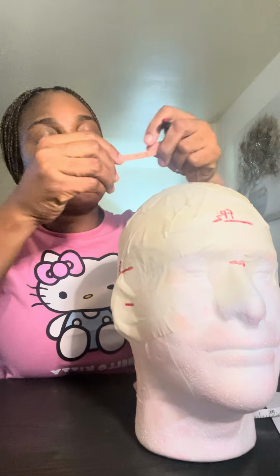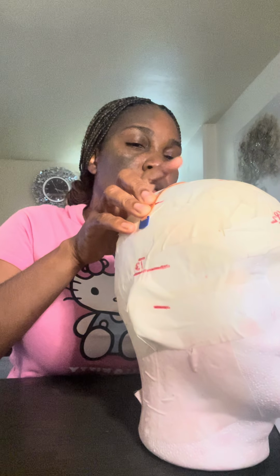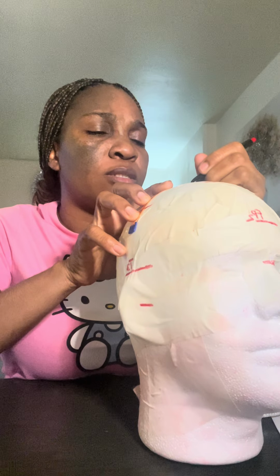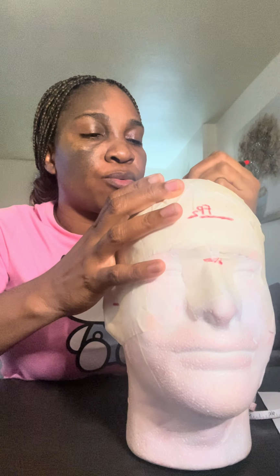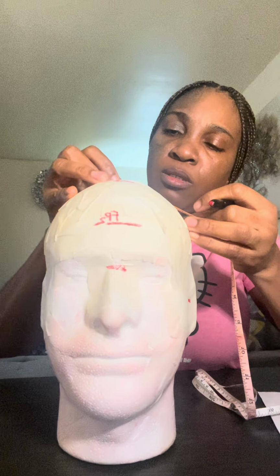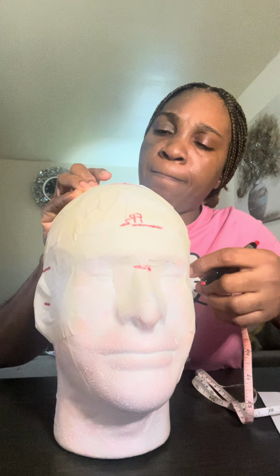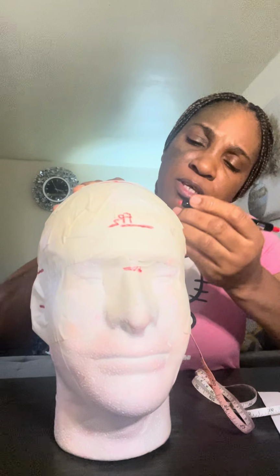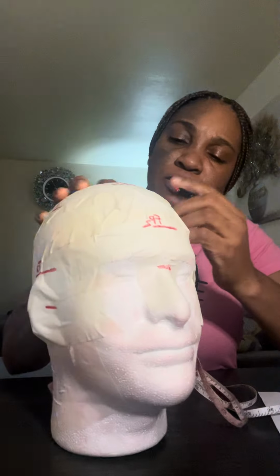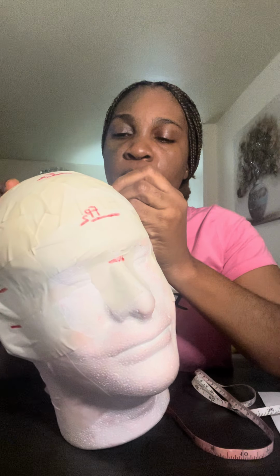From my C3, going to preauricular right, passing through CZ, 20%, which is 6.8. This is going to give me my true CZ. From my true CZ, going 20%, 6.8. This is going to give me my C4. Okay, this is my C4.